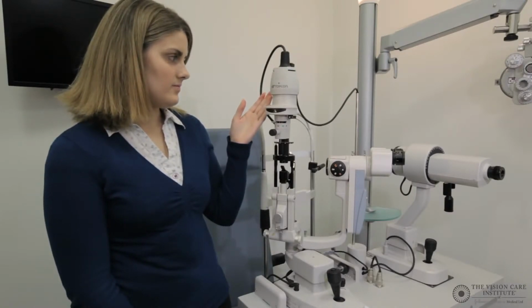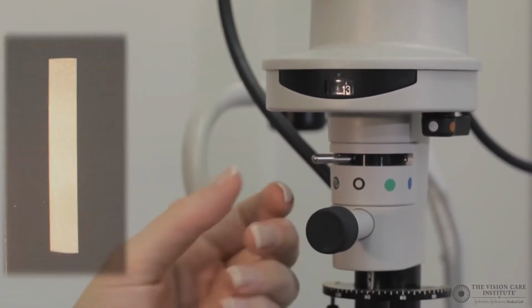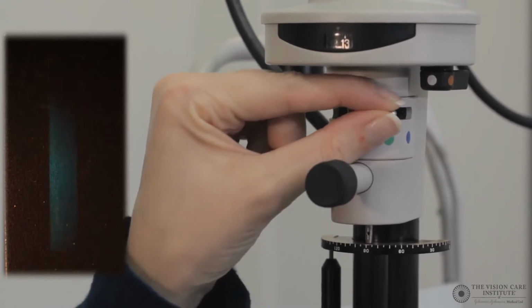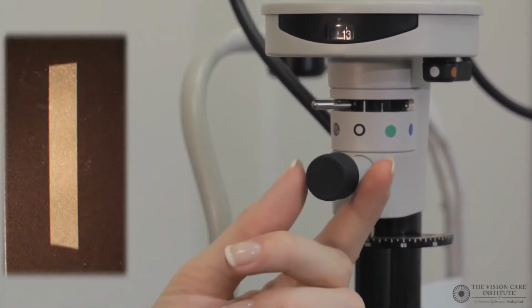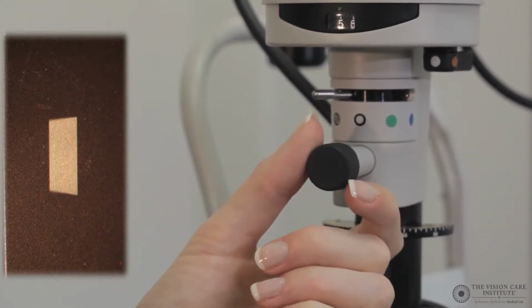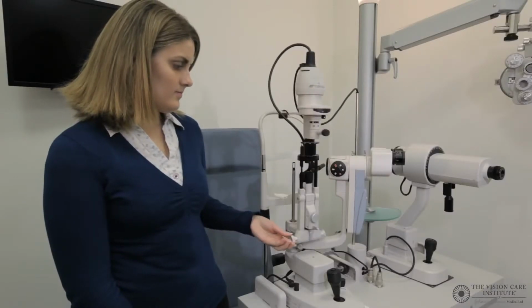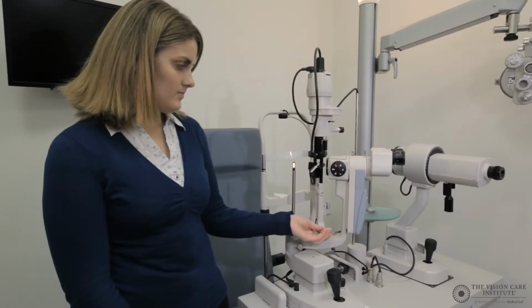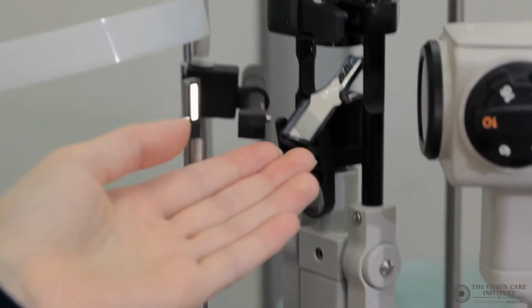The light source is then directed through a series of filters and an aperture so that the height can be adjusted. Here we can see the filters being altered. Here we can see the height of the slit being altered. The width of the slit can also be adjusted. If we move the illumination system out of the way, we have the light source that is reflected off this front surface mirror and directed towards the patient.